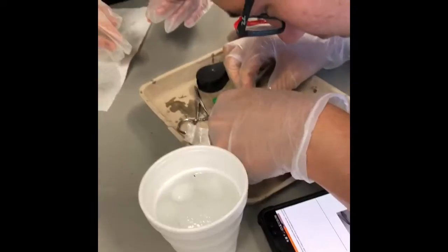Use a needle to poke a small hole behind the head in the exoskeleton of the thorax, but don't go too deep or you can harm the roach and affect the experiment. With the tweezers, insert the center electrode through the hole.